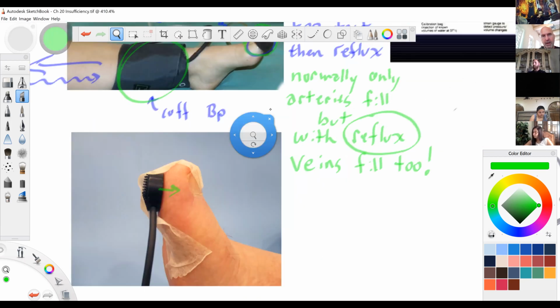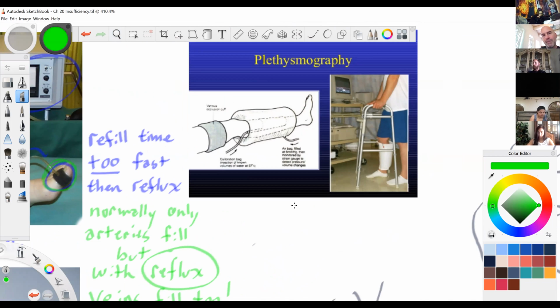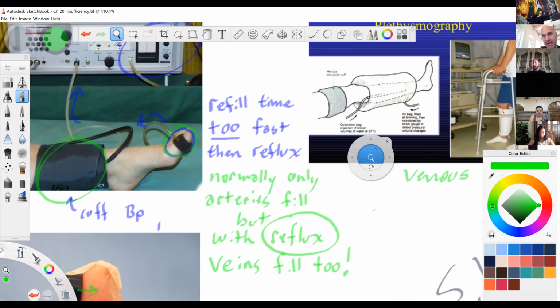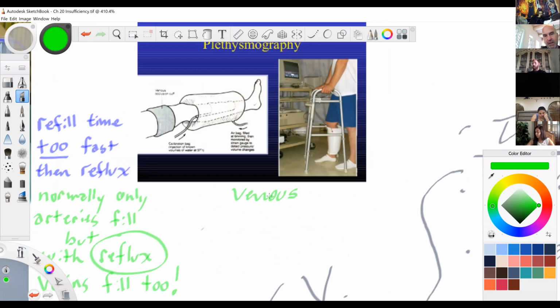Oh, that's smart. I just have another picture of air plethysmography. This one might be a little more appropriate to venous. And so here's the honest truth, guys. I've never used, never even seen a venous plethysmography. This actually looks like arterial, but they're the same exact concept, really. So same difference. Dang it. This looks like venous. This looks like a much weaker cuff, but perhaps more sensitive to blood volume.